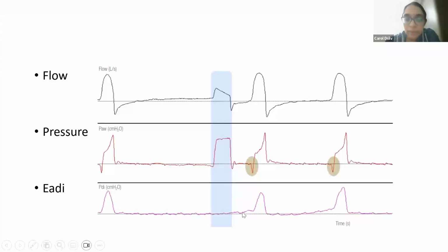Okay, it's all right. So SIMV mode? No, this is not an SIMV. Mandatory breath? This is the mandatory breath? Okay, not really, because you're seeing there's a decelerating flow. If it was a mandatory breath, you would have seen a different flow, like a flow controlled.